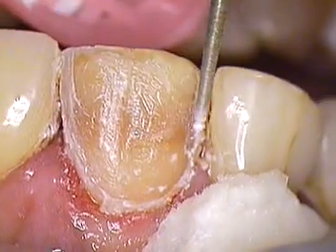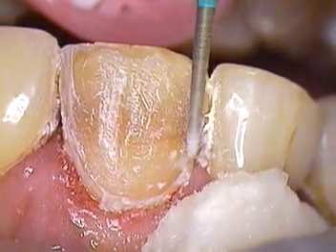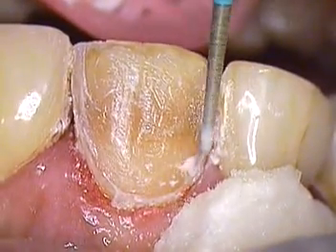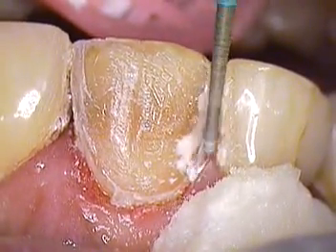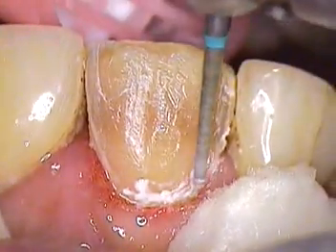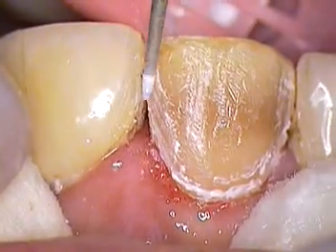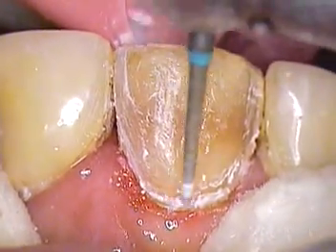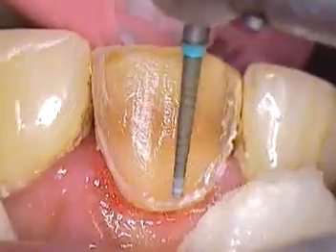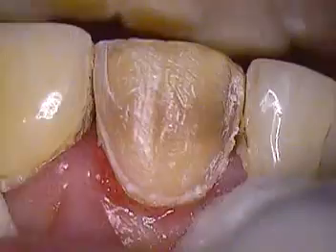All right, now this tooth is just about free from the old dentistry, and we notice that the soft tissue has covered more of the cemento-enamel junction. So we're going to pick this up in the next segment. Dr. Jerry Cuomo.